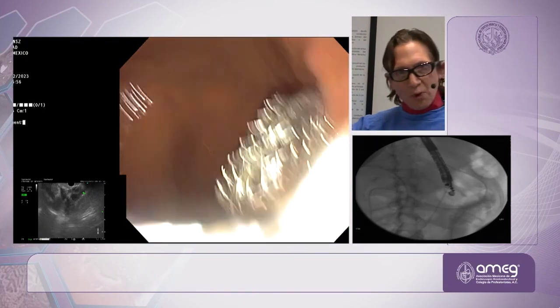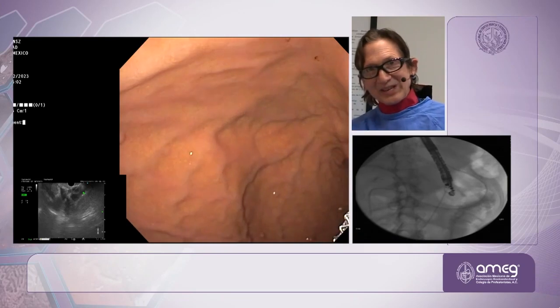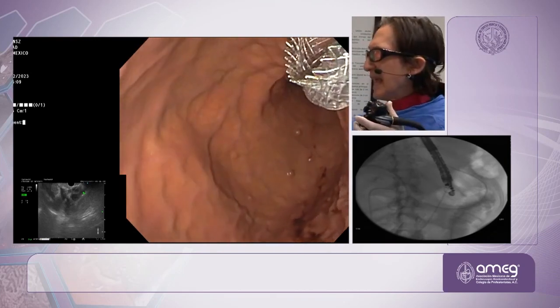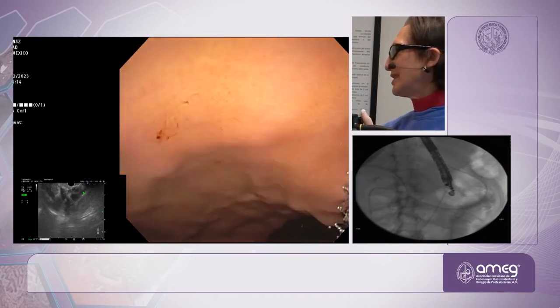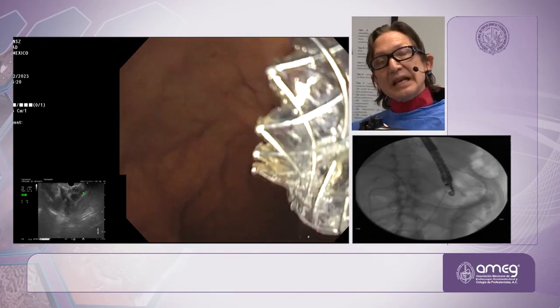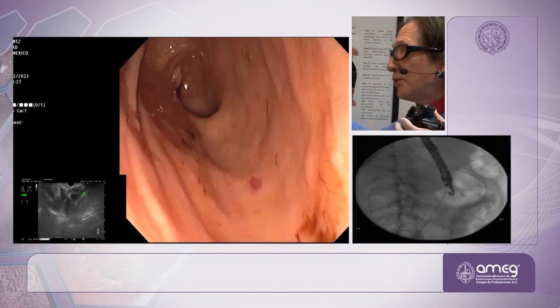It's on the posterior wall of the proximal stomach. This is the perfect placement. It looks great. And by the way, we can take out the nasal enteric tube. Now we don't need that anymore. So pull it out. But this is a beautiful result. And so now the food has two routes. It can go this way through the gastroenterostomy, and it's going to actually preferentially go through here because this is where the food collects first. But then food can also go this way.